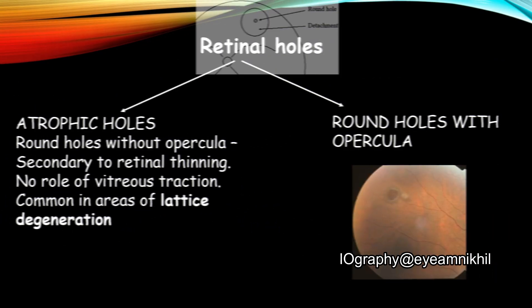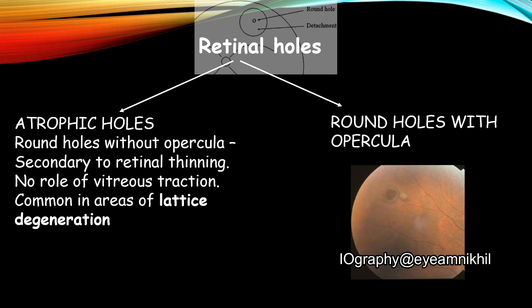Let's talk about retinal holes now. Retinal holes may be atrophic holes, which are more common in areas of lattice degeneration, or they may be round holes with opercula, which are caused by vitreous traction.